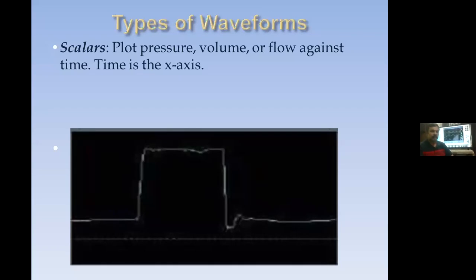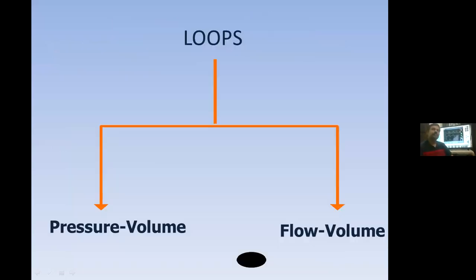The y-axis will be the volume of the gas. The x-axis will be for the time, how much time they are maintaining. This kind of waveform is called a scalar wave. So, scalar waves and loops.